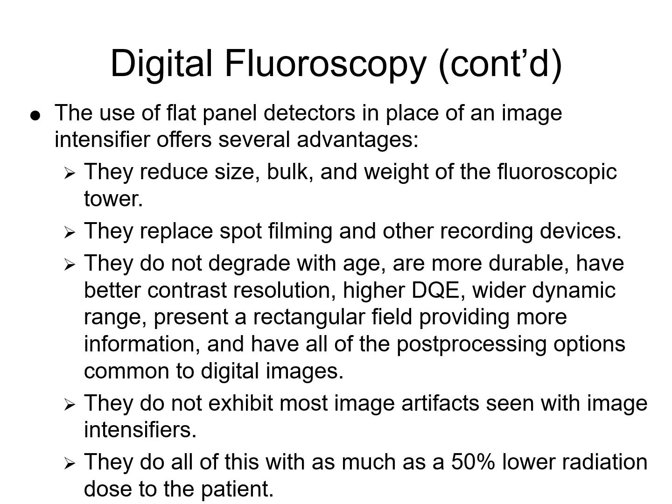Great contrast resolution. It preserves the attenuation differences, and it's a one-to-one transfer again, a conversion of that X-ray photon to ultimately a stored positive charge on a capacitor in a pixel. That's a one-to-one conversion. So when it counts positive charges, each one of those stored positive charges is basically representative of one X-ray photon. Okay.